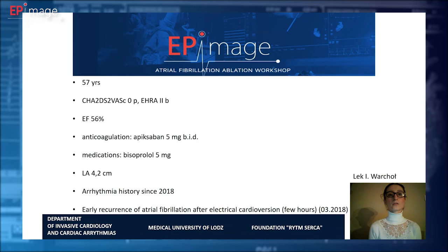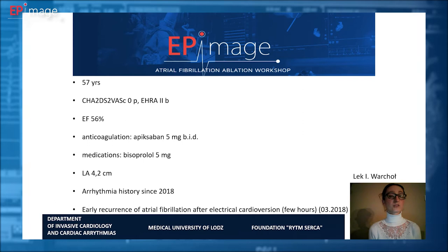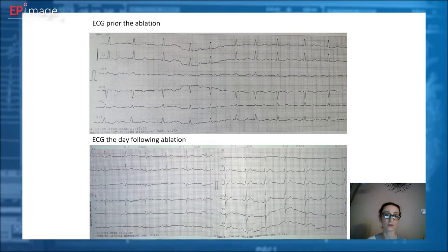A 57-year-old patient presented to our department with a history of long-standing persistent atrial fibrillation since 2018, and after one temporal successful atrial cardioversion, that is a few hours, also in 2018. Echocardiography examination revealed preserved left ventricular ejection fraction with left atrial diameter of 4.2. Presented figures present electrocardiograms prior to and following ablation procedure.